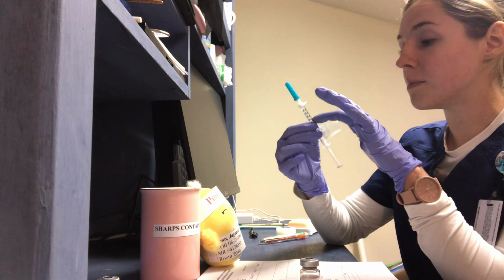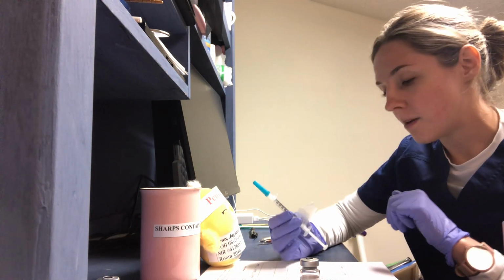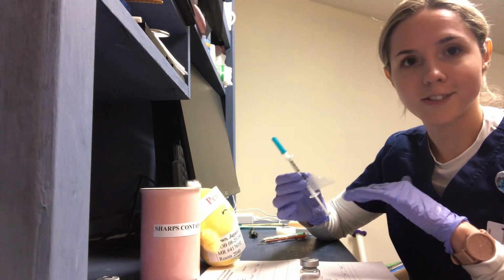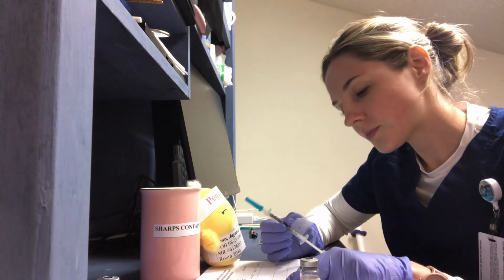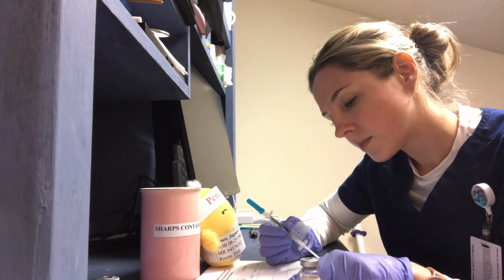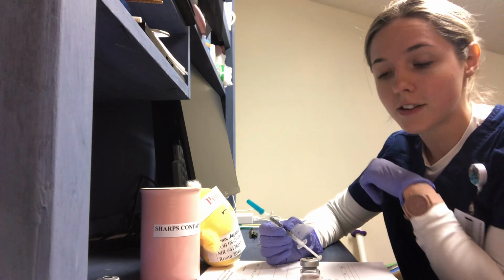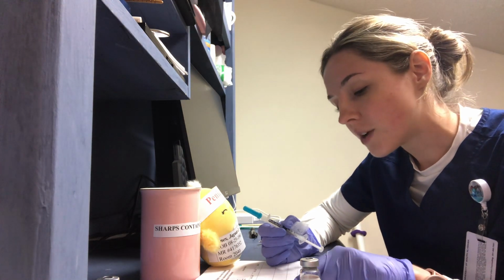We want to double check the amount in our syringe, make sure our label is correct. And also when you're checking the right patient, it's good to check your syringe and make sure it says the right patient name because you have it on everything. So that matches too. The right route, subcutaneously, I have my injection pad. I'll explain the subcutaneous route in just a minute. The right time, every 12 hours.